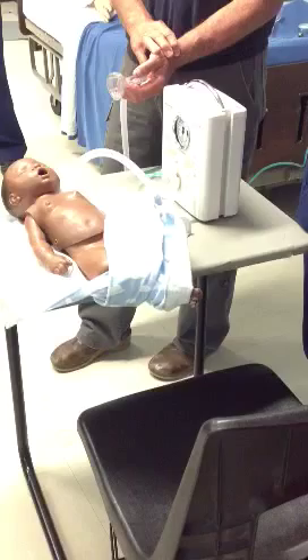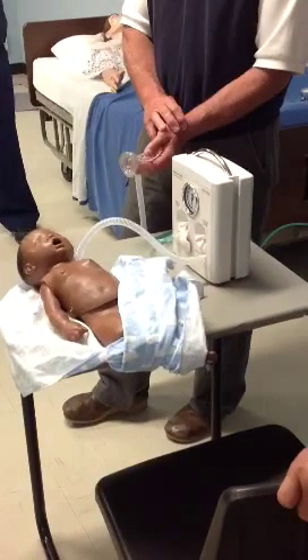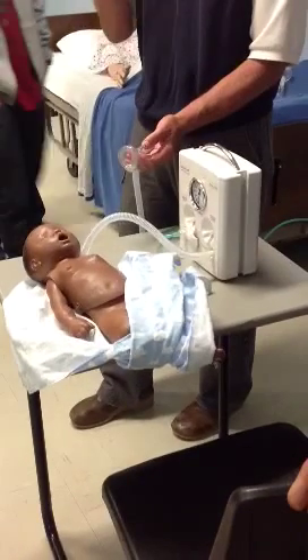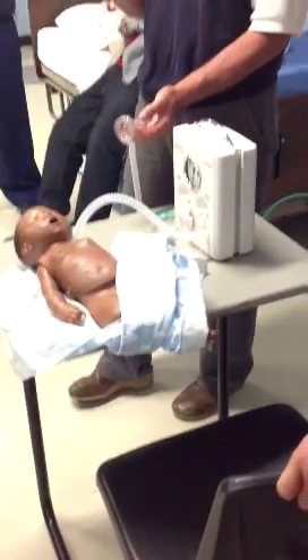The operator doesn't become fatigued. There's one more — there's one more that's even more important. This is why it's used in a delivery room: it provides consistent pressure every time.